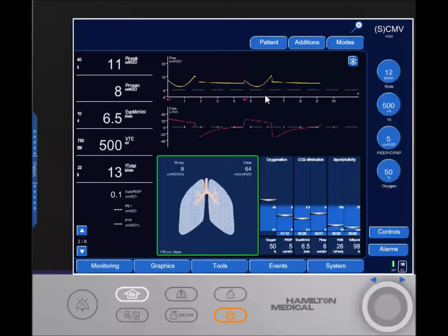Another feature that we can look at to see how synchronous a mode is: once the patient starts triggering breaths, are all the breaths spontaneous? And as you notice here, they're not spontaneous. They're still for a certain amount of time. Is the patient trigger and cycling based on a signal representing chest wall or diaphragmatic movement? And no.